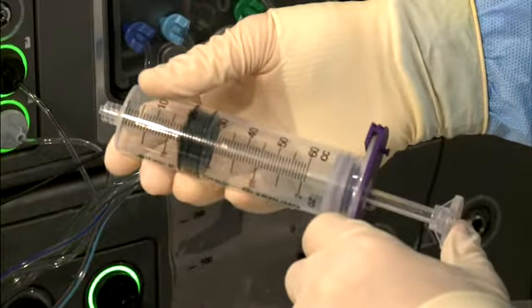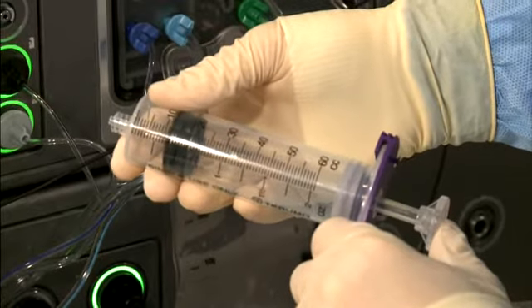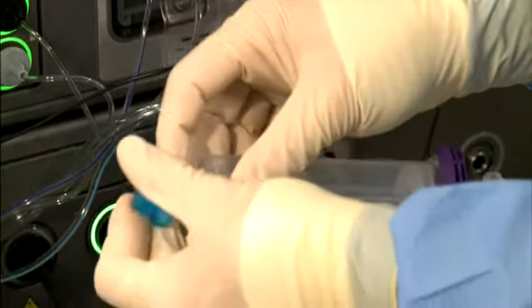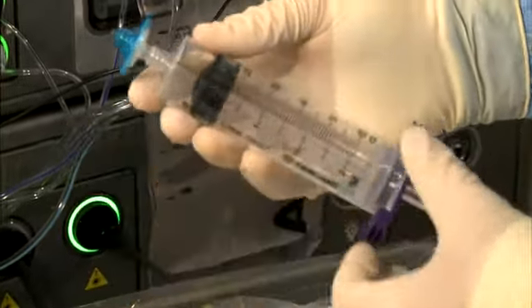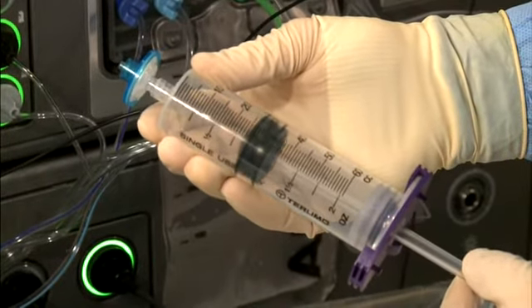The auto gas fill syringe assembly is filled with 20 cc's of the selected undiluted gas and is ready for mixing. Push the plunger until the desired amount of pure gas is in the syringe. Before mixing with air, attach the extra filter to the syringe assembly.